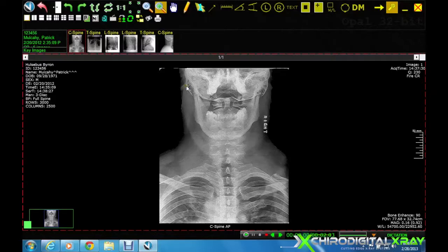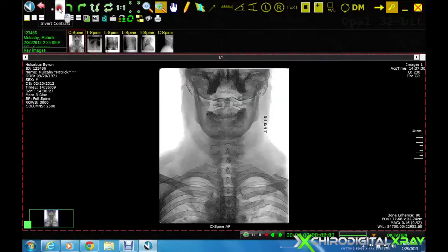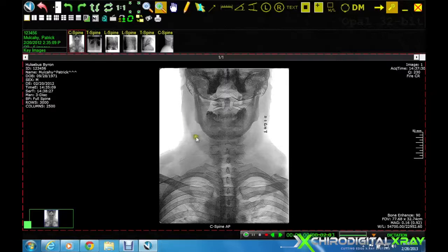The invert contrast tool allows us to view the image as a negative. This makes it easier to see a fine bone cortex fracture or to locate a soft tissue structure that may not be clearly visible to us in regular viewing mode.